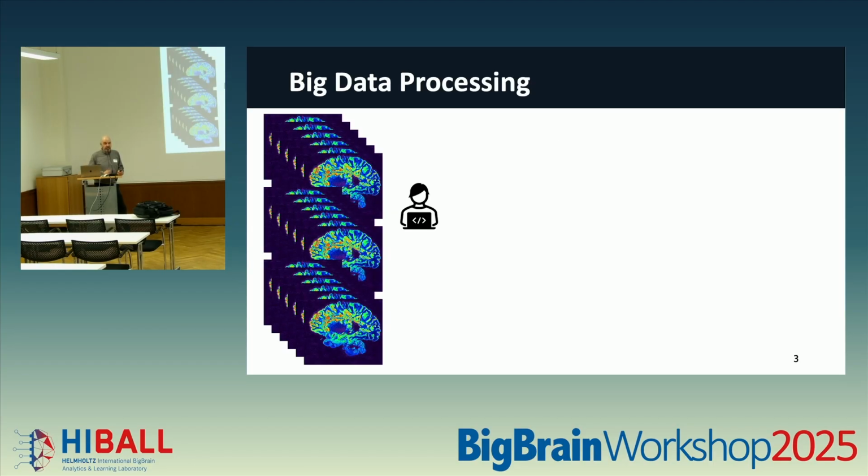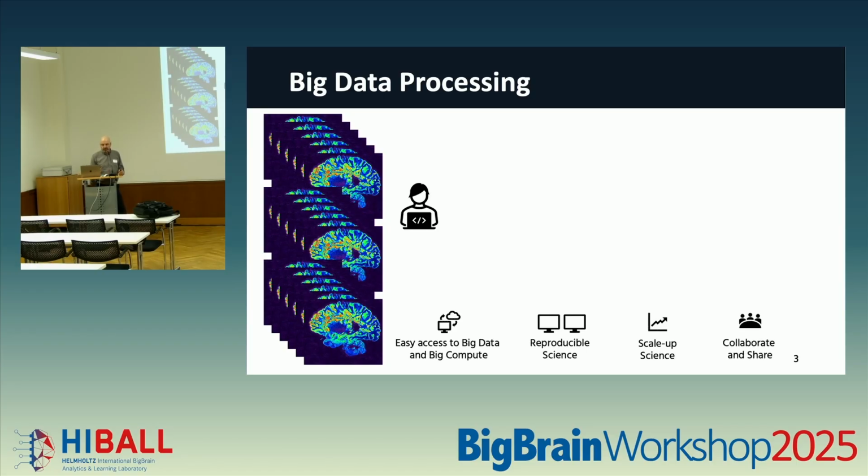As I was mentioning during the pitch session, there are all kinds of different data modalities that people can work with. If you're working on the imaging side, particularly MRI, you're not going to be doing it just once, you're going to be working with it many times. You want to make sure you're doing it at scale.